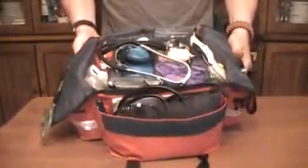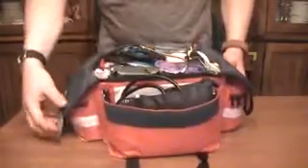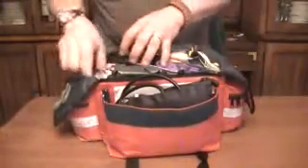Also, in this kit, you can see everything's pretty well organized and compartmentalized. When you talk about airway, I also keep nasal airways and some lubricant for those airways in my kit. If you don't know how to use them, don't keep them in your kit. I keep a CPR mask because now we're talking about airway and breathing.